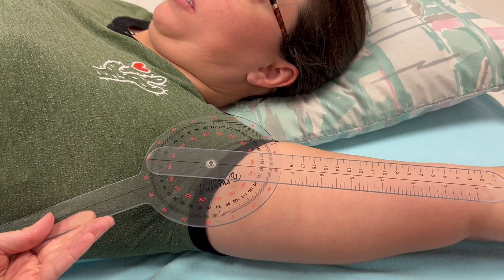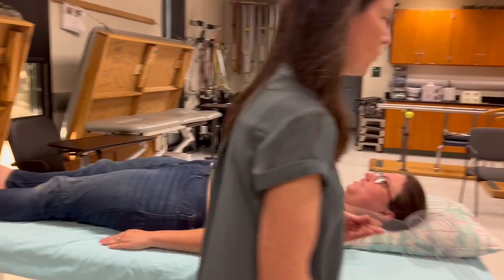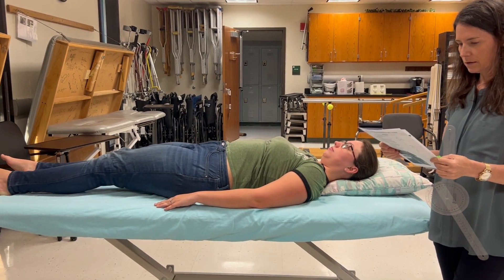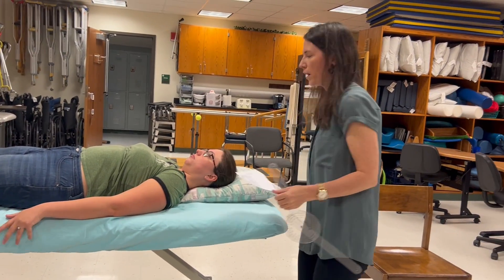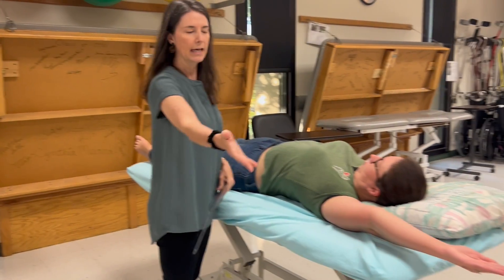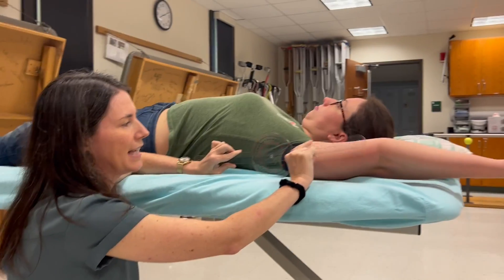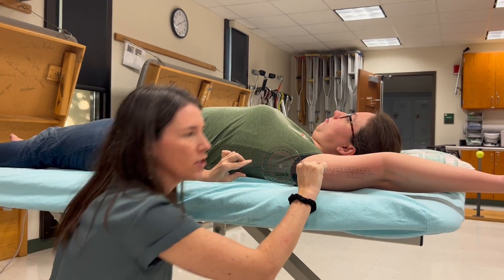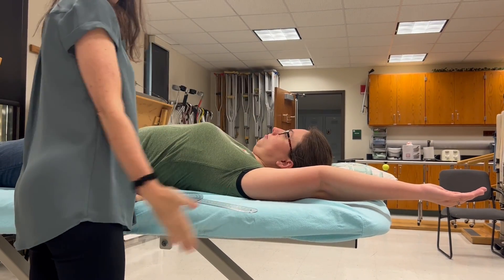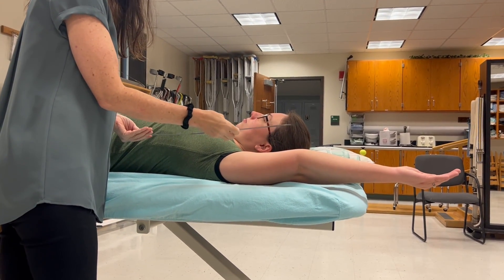One of the mistakes we commonly see is the student will have someone abduct perfectly, and then they're down here measuring flexion because the goniometer is moving in the sagittal plane — that's a measurement of flexion. The end range of flexion looks very much like abduction, although with abduction the palm is facing up to the ceiling, and with flexion the pinkies are up to the ceiling. So just make sure your goniometer is in the plane that you are measuring.